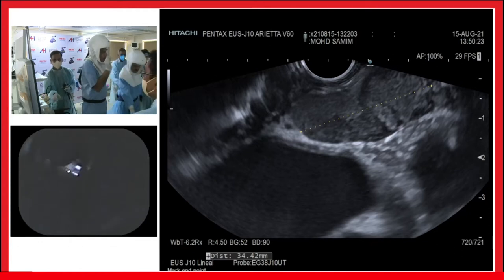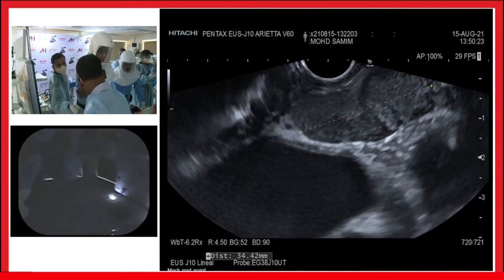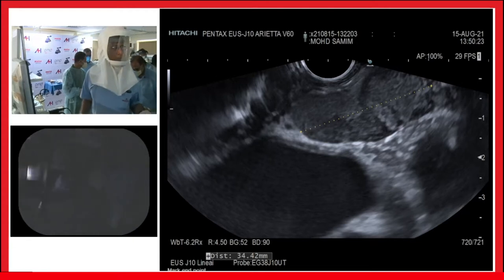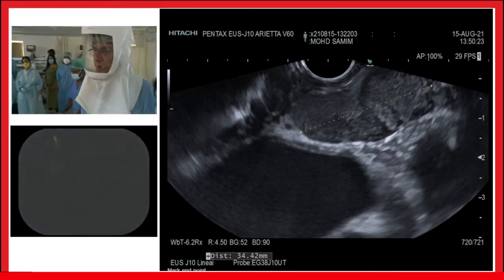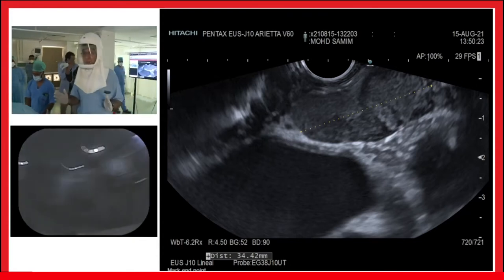You find a 5 millimeter lymph node in the pulmonary ligament, don't put in the scope. You find a 5 millimeter node, that is no problem. Okay, you change the scope. Give it to me. What needle is this? The second thing is size.